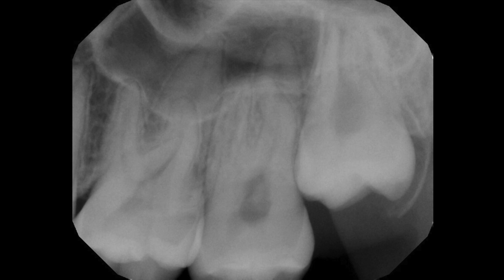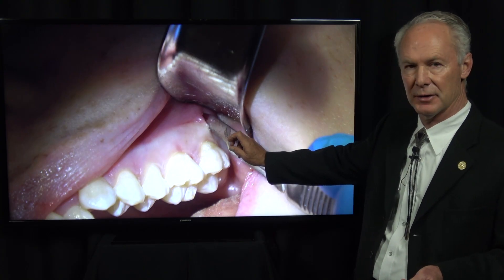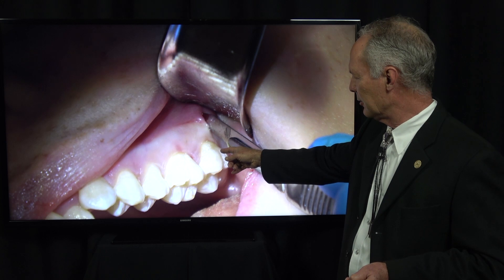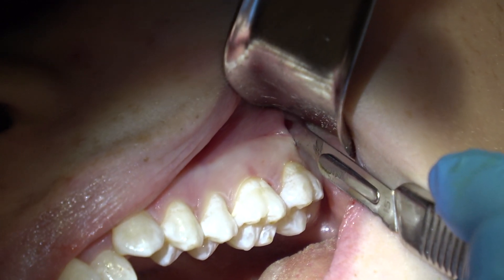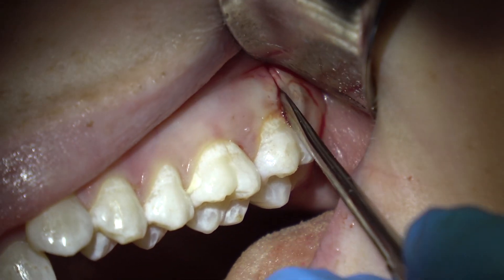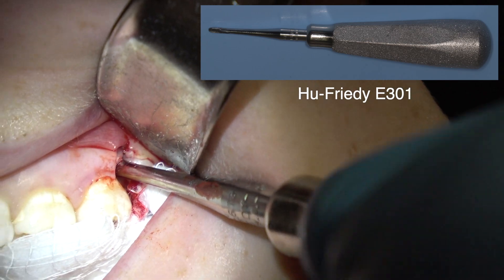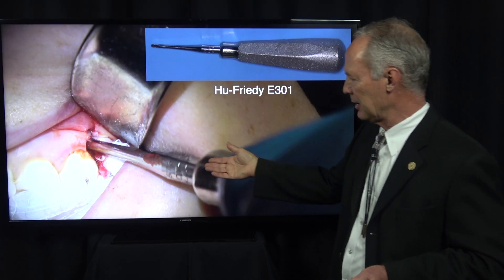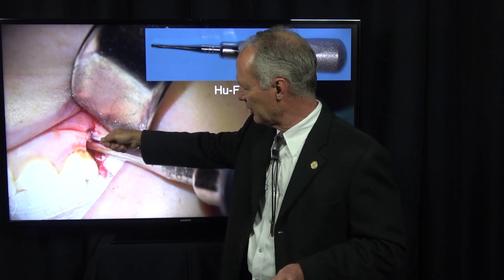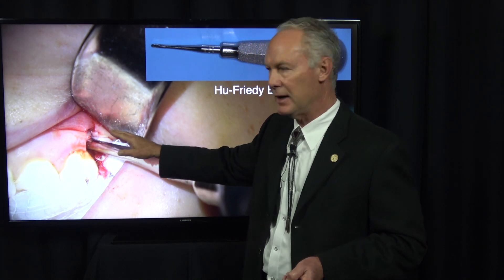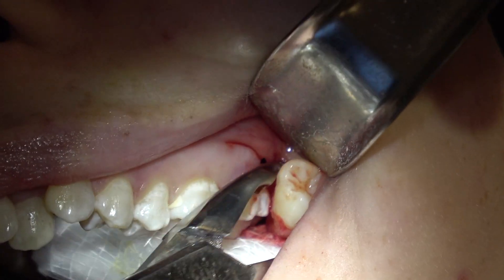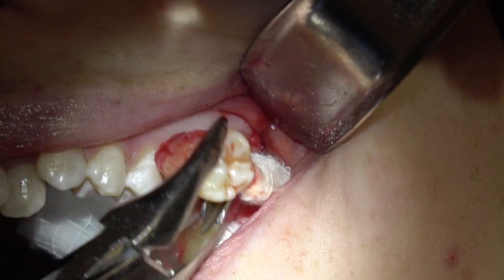Now I'm removing the maxillary wisdom teeth. I gave an intraligamental injection on this wisdom tooth also. Vertical incision on the distal buccal of the second molar all the way down to non-keratinized, non-attached gingiva, then across — making an incision across the distal of the second molar and then around the facial. I'm elevating the flap with a periodontal periosteal elevator, then placing that periosteal elevator between the wisdom tooth and the second molar and just torquing it to create space and place the E301 elevator. Be sure you always block the airway with a 2x2.